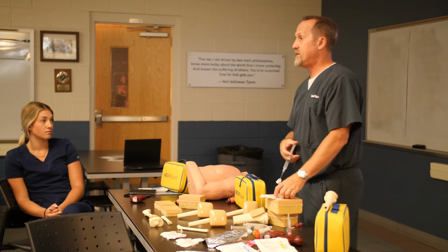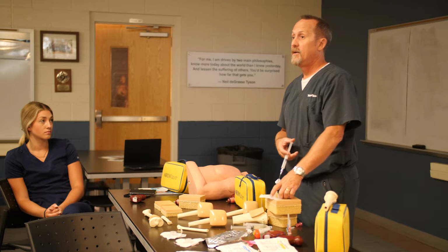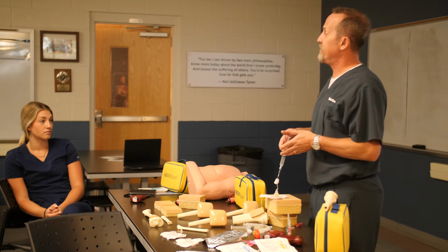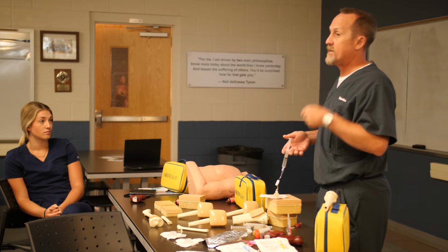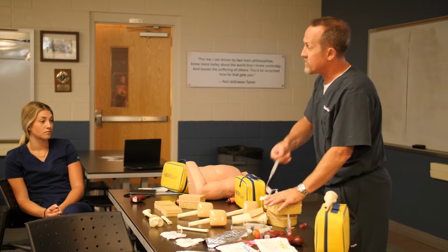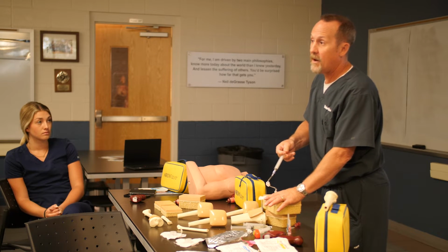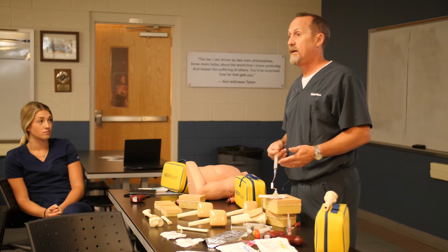On your adult patients, we're gonna do 5 to 10 mils of fluid, and it's a rapid flush, okay? It's important, the mechanism for this rapid flush is to get all that marrow and all that stuff that's inside the bone out of the way so we have a pathway for our fluids and meds to go in. So we're gonna do 5 to 10 mils of rapid flush, okay? On your pediatric patients, it's gonna be more like 2 to 5 mils, okay?